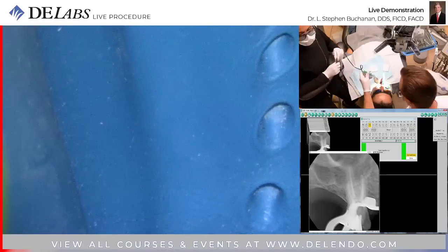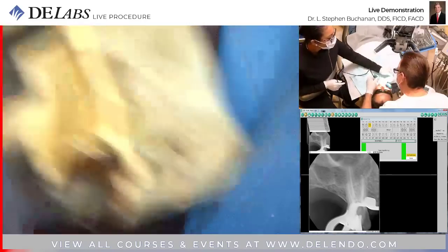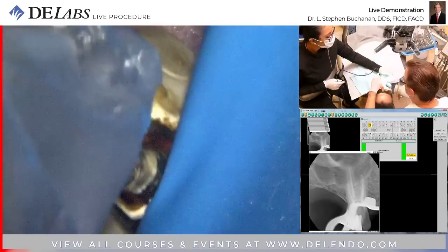Okay, that was the swallow. Let's hold super still this time. Peel that back so I can see better. You got nothing to apologize for. You're an awesome patient.